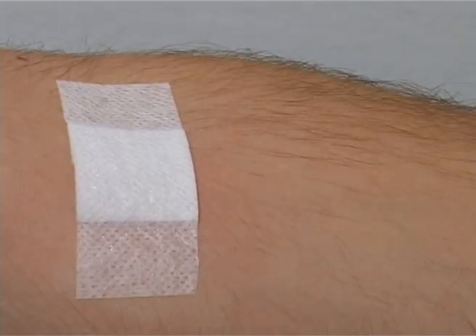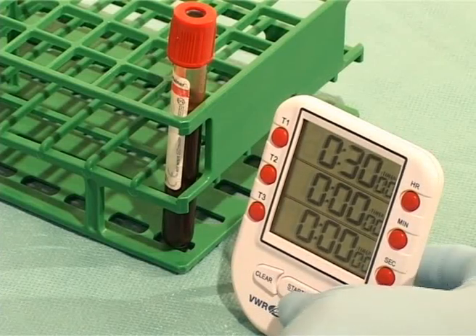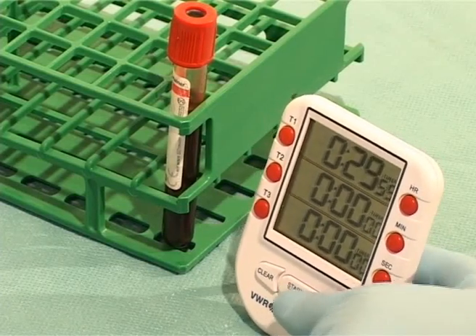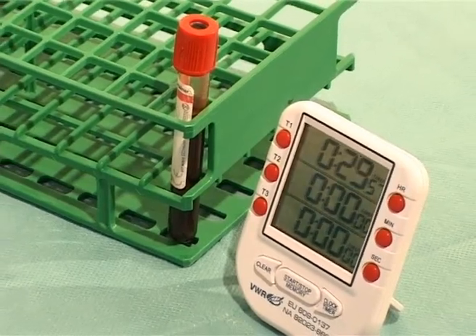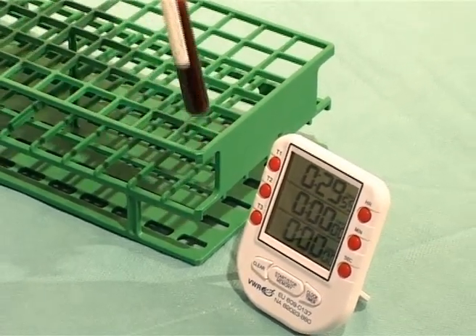The puncture should be done as usual. The coagulation process will last longer than usual, due to the absence of coagulation-inducing substances.